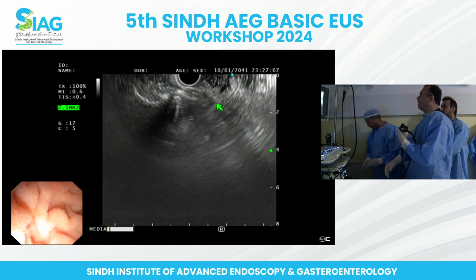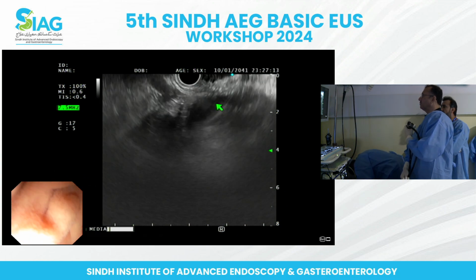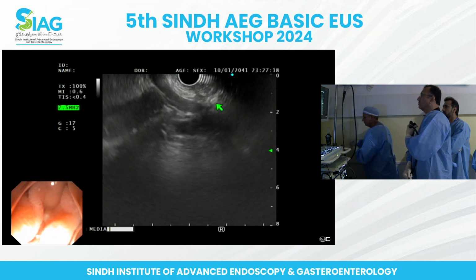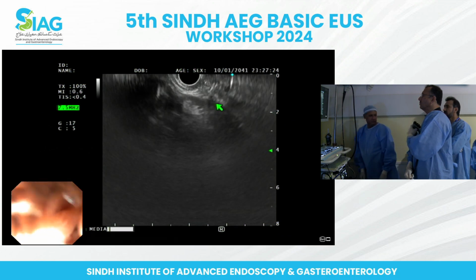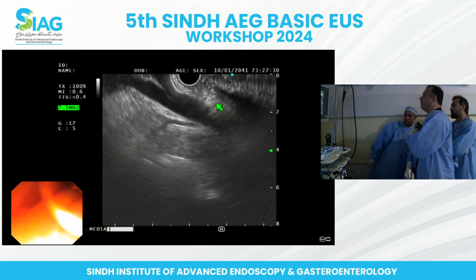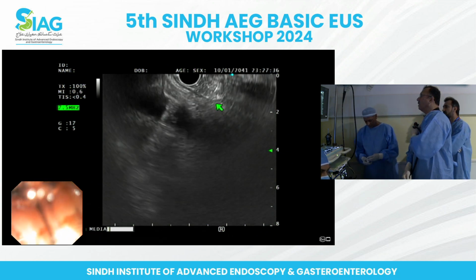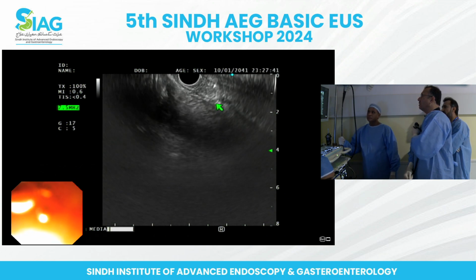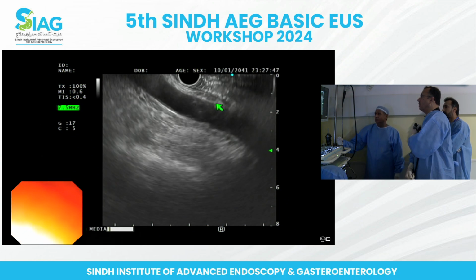Right, I think now I'm comfortable. So once I have this thing on this side, ये आ गई aorta आपकी, ठीक है जी. Aorta to the left, and we have the lumen with the water inside. Things are getting easy for us, and we'll be able to visualize the pancreas in a better way, right?